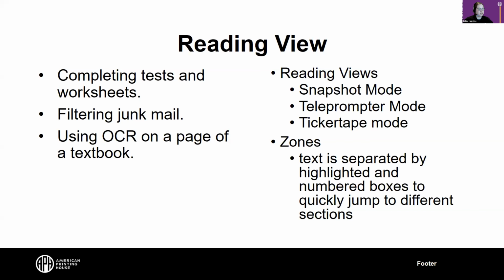Absolutely. And I know that Greg is going to be sharing with us some of the benefits of Juno in its reading view. But when we shared it with field testers, some of the benefits of this reading view with Juno, of course, with its reading and writing views, it's fantastic for completing tests and worksheets. It's a great handheld device for holding up above that stack of junk mail that everyone gets in, filtering it out, seeing what's important, what's worth keeping, what's not. And definitely that function of being able to use OCR on a page of a textbook. These are going to be great benefits for students.